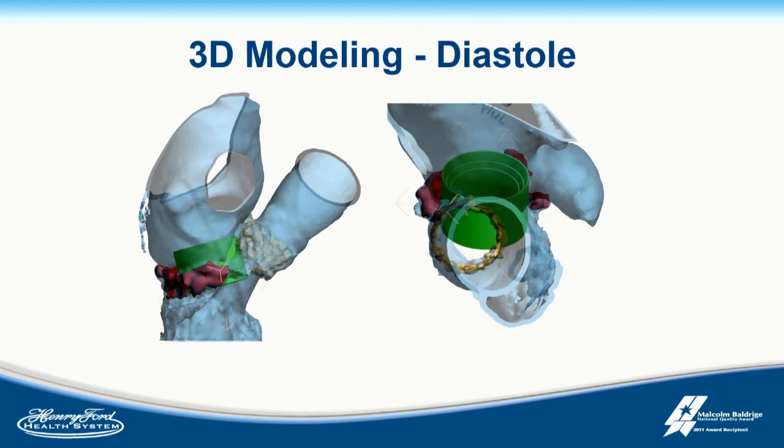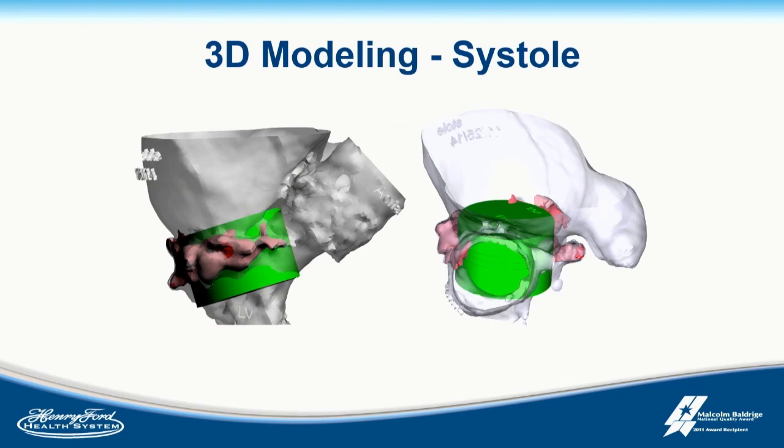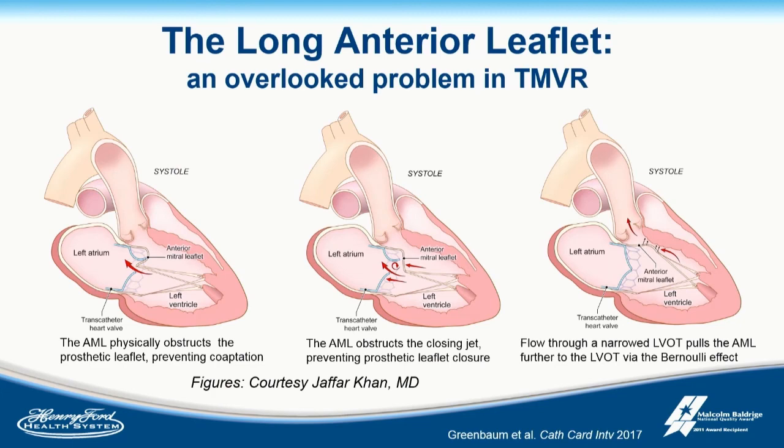When you look at what happened in this patient, this is all work by Didi Wang, and again, CT has been a lifesaver now for this procedure, but when we didn't know what we were doing, we were sizing them on diastole, thinking we need to know how big the valve needs to be because we worried about embolization. What we didn't realize is systole is a whole other ball of wax, and so this patient clearly had no flow left when the valve went in. And so obviously the permanent displacement of the anterior leaflet is an issue.